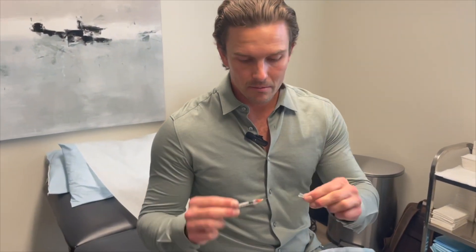Put the cap back on the needle and replace it on the syringe. Always make sure that you dispose of your syringe inside some kind of plastic container, which can then be taken to a medical recycling facility.